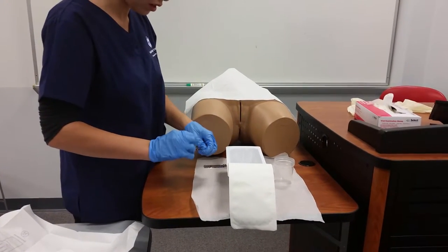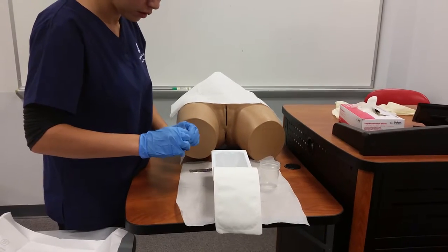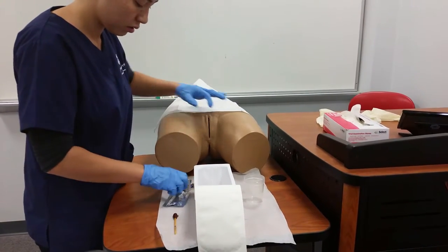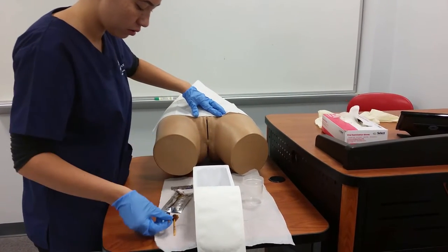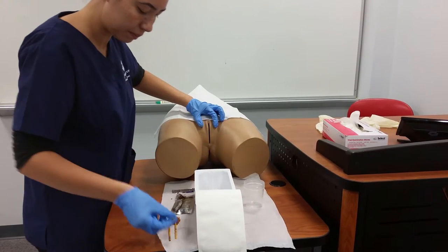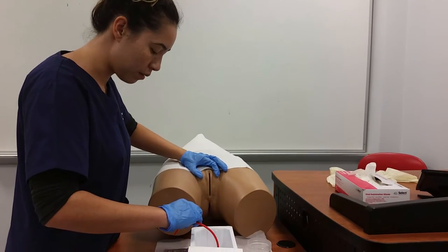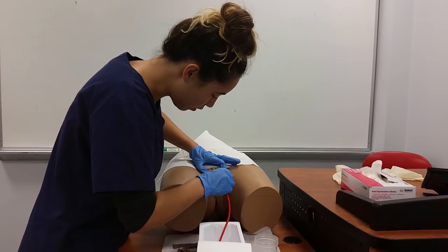I'll then open my gloves and I would clean the cavity going down, down the middle. From there, I would move this forward and I would insert the catheter. I would dip it into the lubricant and then from there insert the catheter into the patient.